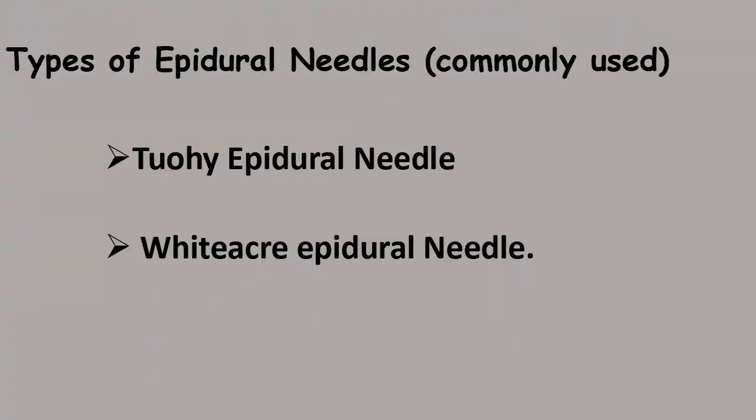Types of epidural needles, commonly used. Tuohy epidural needle. Whitacre epidural needle.